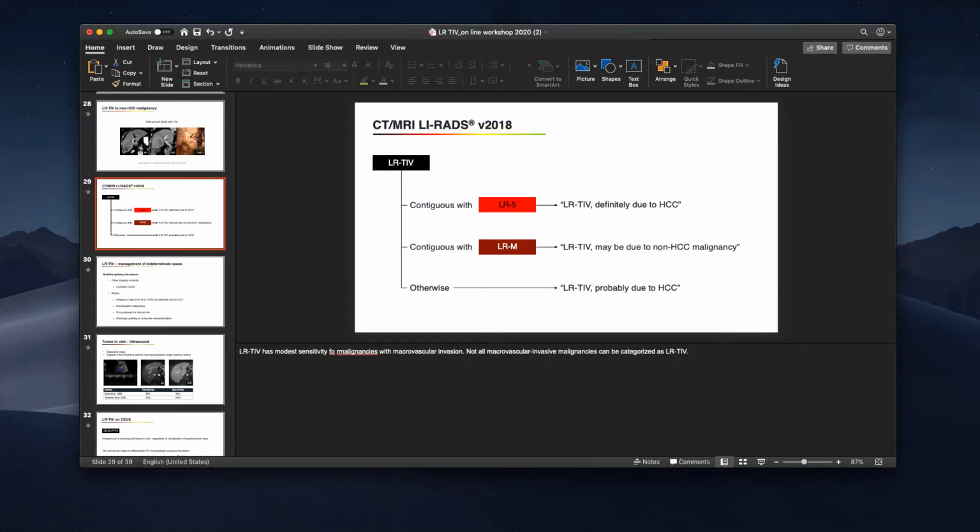The enhancement does not necessarily have to be on the arterial phase, right? You can assess the arterial and portal venous phases for that enhancement. If you have an MRI and you have doubts about the enhancement, in that situation I think it would be helpful to get subtraction images, unless they are very artifacted. But for CT, I'm not aware of a recommended threshold.